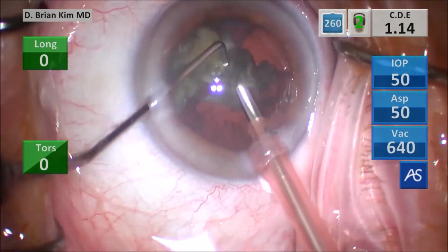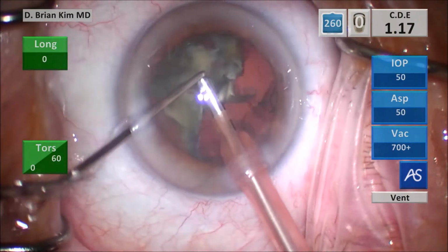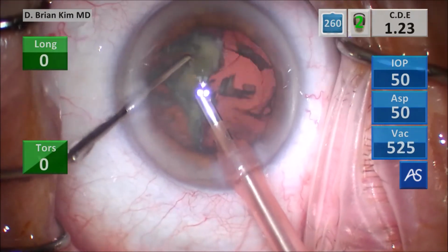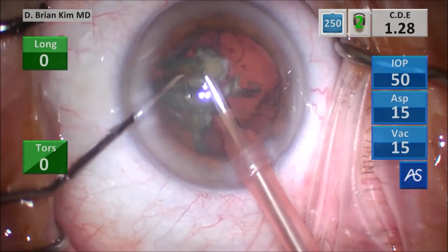A lot of this is really quite tactile. When you're pulling it centrally and you're having the phaco tip on the other side, as the instruments are closing in, you can feel it. You can feel it encounter some resistance. And then as you squeeze both instruments together, it crushes it.